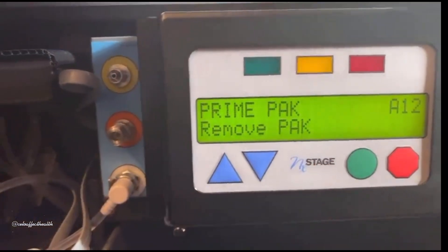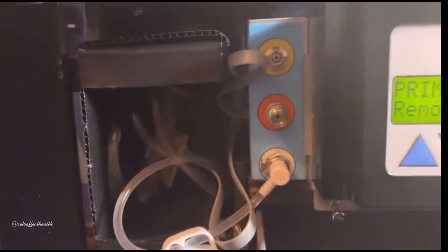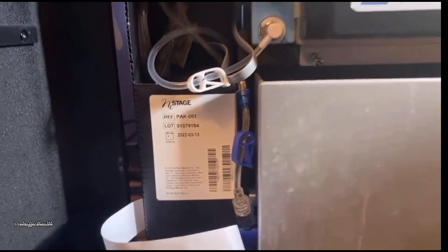Priming a new pack for your Pure Flow on the NxStage dialysis home machine.